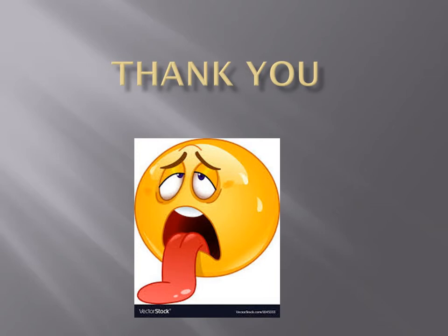First of all, thank you for your exceptional effort in preparing all of this on very short notice. Second, just a few notes. One of the things clearly said in the chapter is that the use of contrast is not very important in defining the tumor. You use contrast in MRI just to see whether it is a cyst or a soft tissue tumor that is so bright on T2. Otherwise, there's no need for contrast.